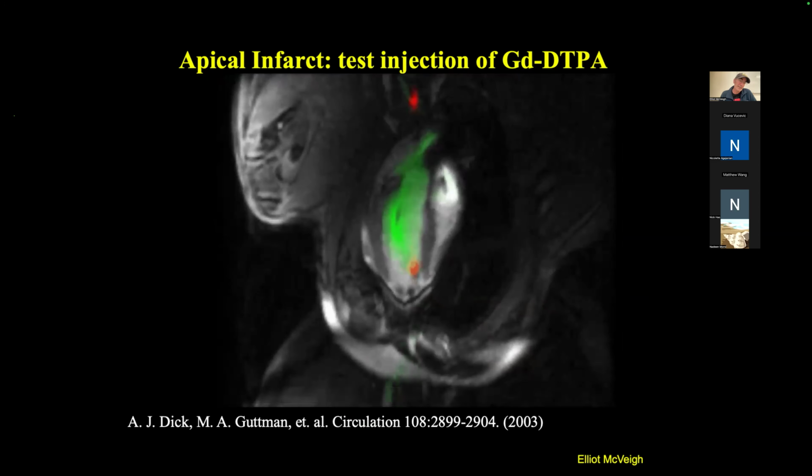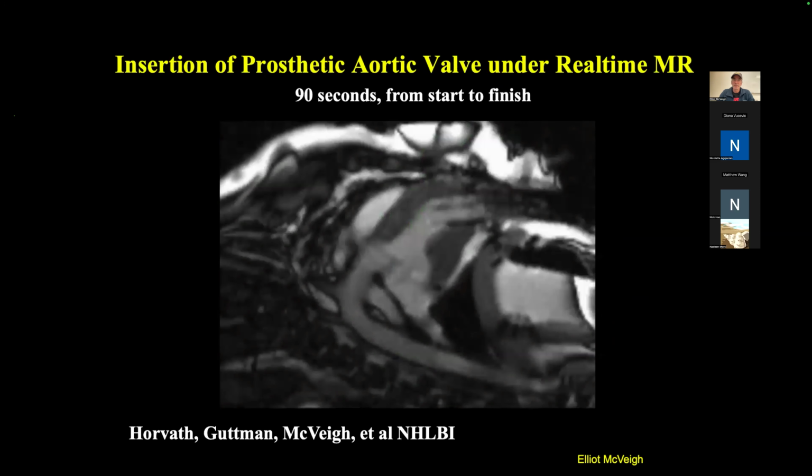Technologically, it's really hard to do this in the heart. Obviously, it's easier to do it in, say, the liver, where you have a tumor or some other tissue that you want to ablate, and it pretty well stays in its location, and then you can move this in and see where all the injectate goes. It's a pretty cool application.